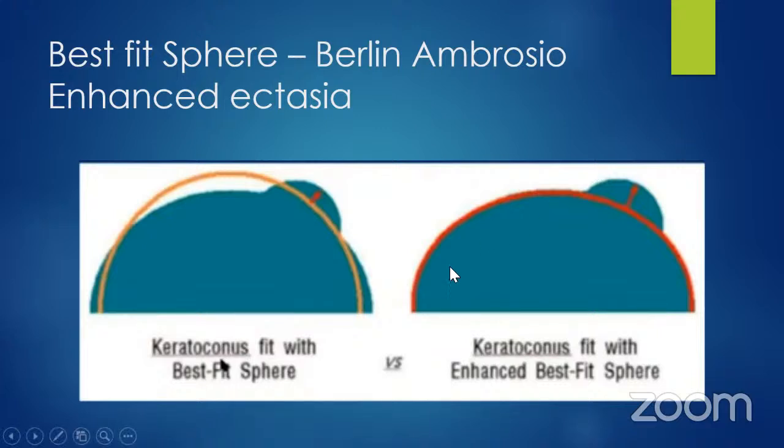So if I use an enhanced best fit sphere, what it is doing is excluding that area of ectasia. Last time I had given the same example: if there are 10 students and one student gets 99%, and all the other 9 get around 50% to 60%, and you take an average of all of them, you will say the class is scoring around 75%. But we will not come to know who is that one outstanding student who is getting the highest marks, right?